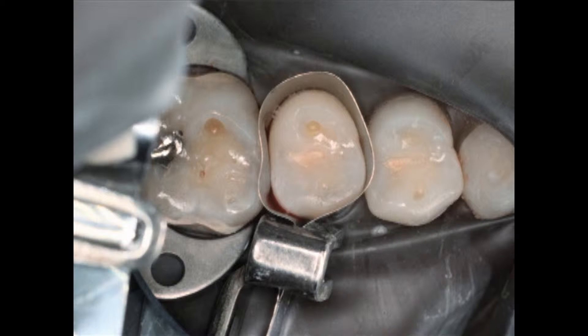I put a matrix band on, and you may notice all my matrix bands come straight out. It just makes my life easier — I don't have to worry about whether it's upper right or lower right; they all fit.